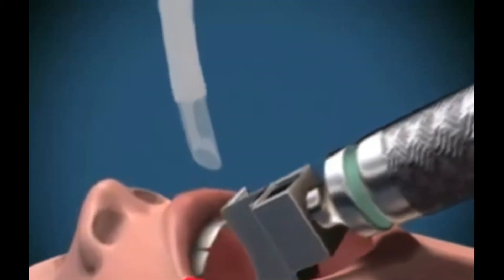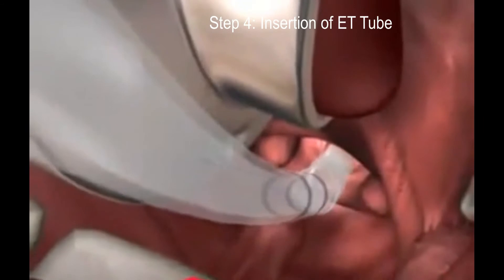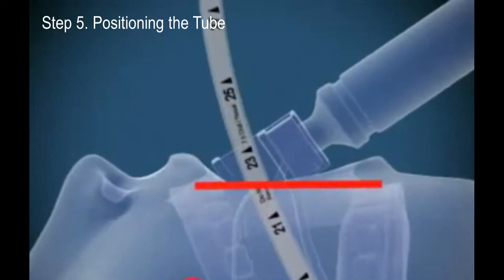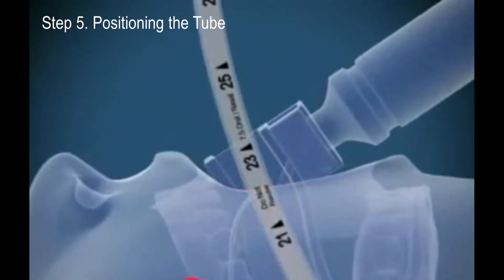With the right hand, insert the endotracheal tube from the right hand side of the mouth directly between the cords and into the trachea until the cuff passes through the cords. The markings on the tube at the incisors will show between 21 and 24 centimetres in the average sized adult when the tube is in position.